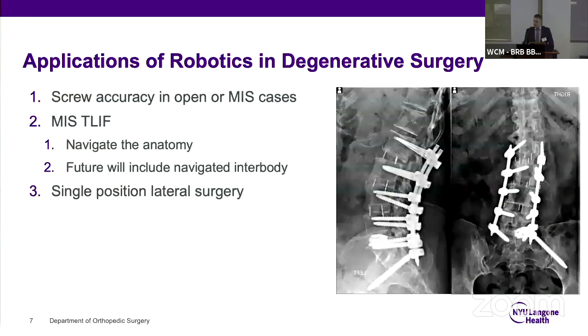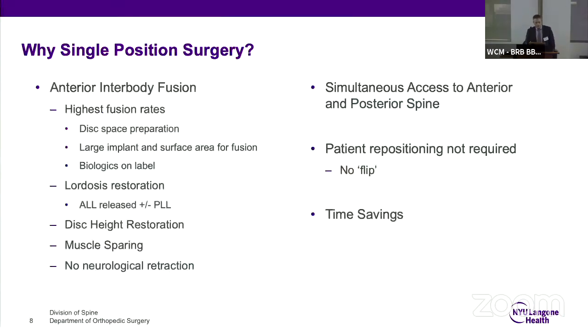And then I think this is a seamless transition to single position lateral. And I didn't embrace this type of surgery until robotics came out. I was doing some cases fluoroscopically using single position lateral, but until the robot came out, I really didn't embrace it, partly because it takes a toll to wear lead and be in a lateral position and put downside screws, and I didn't want to do unilateral fixation.